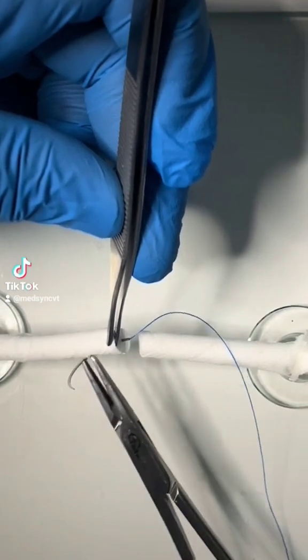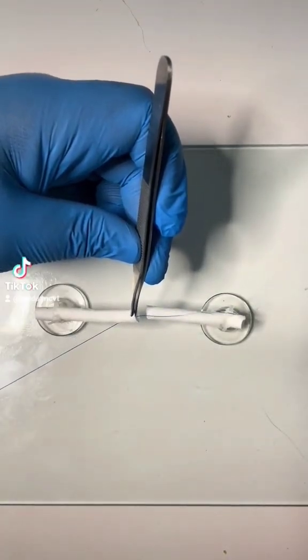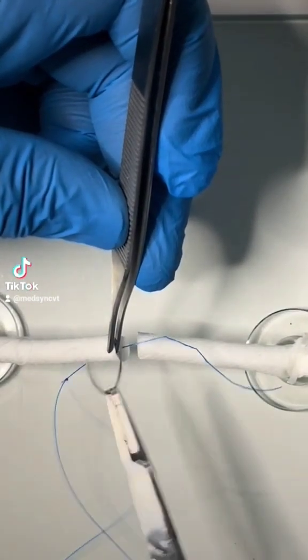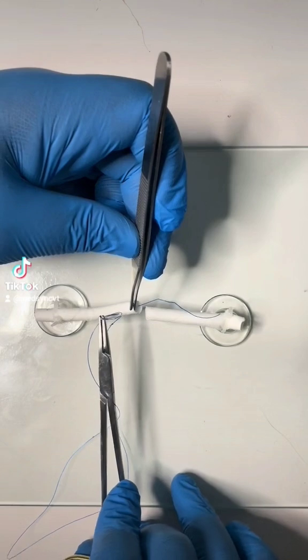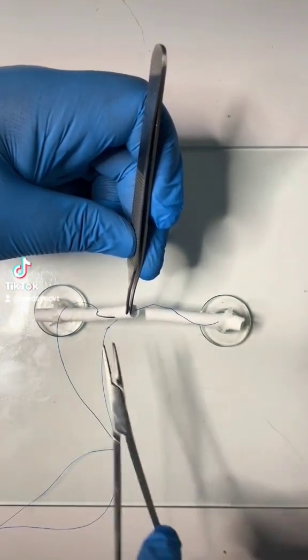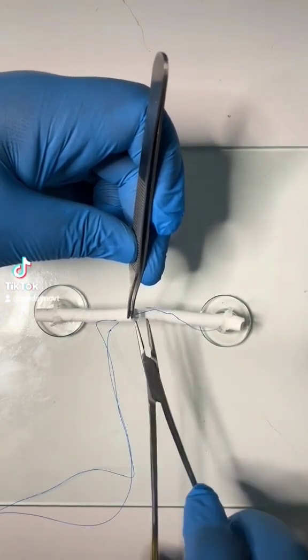You start with an oblique bite from the site of division, exiting one centimetre distally. Without letting go of the tendon, with the needle holder ratchet unlocked, manoeuvre the needle such that you can take a longitudinal bite on the anterior surface of the tendon through its core substance, exiting at the site of division.